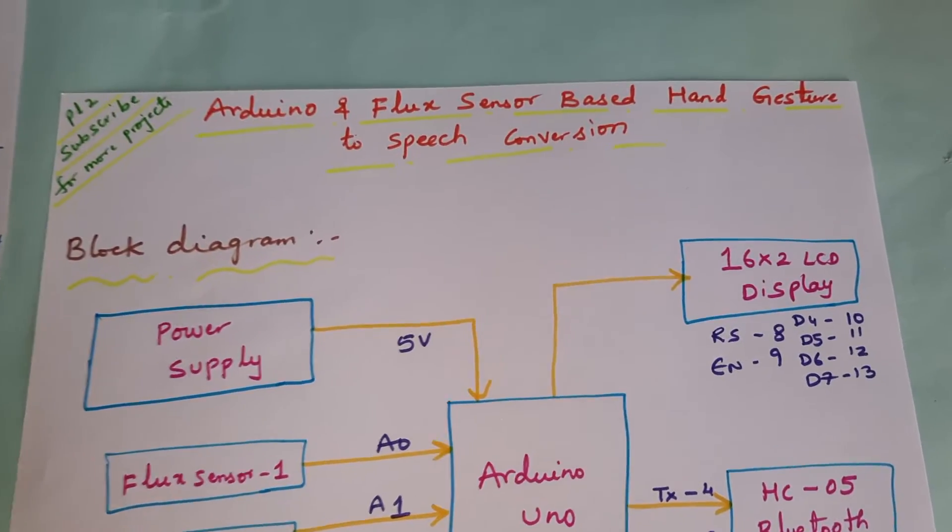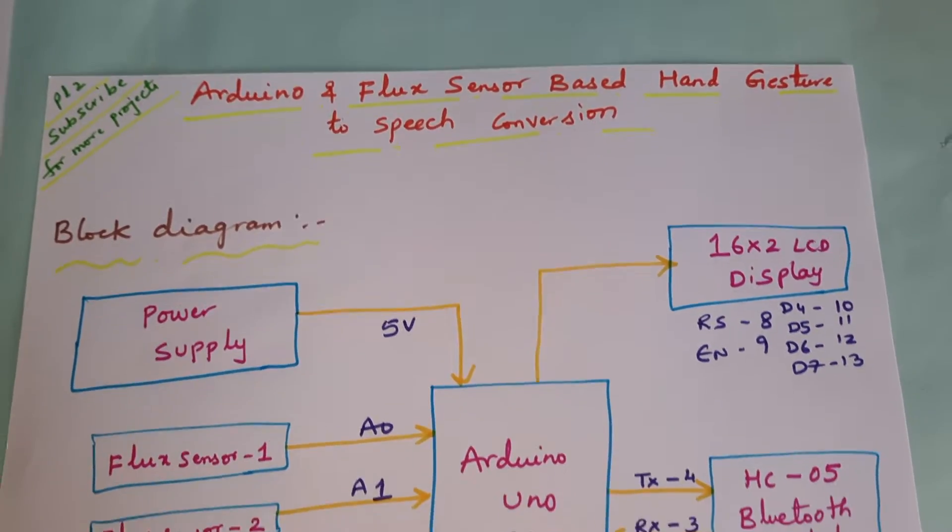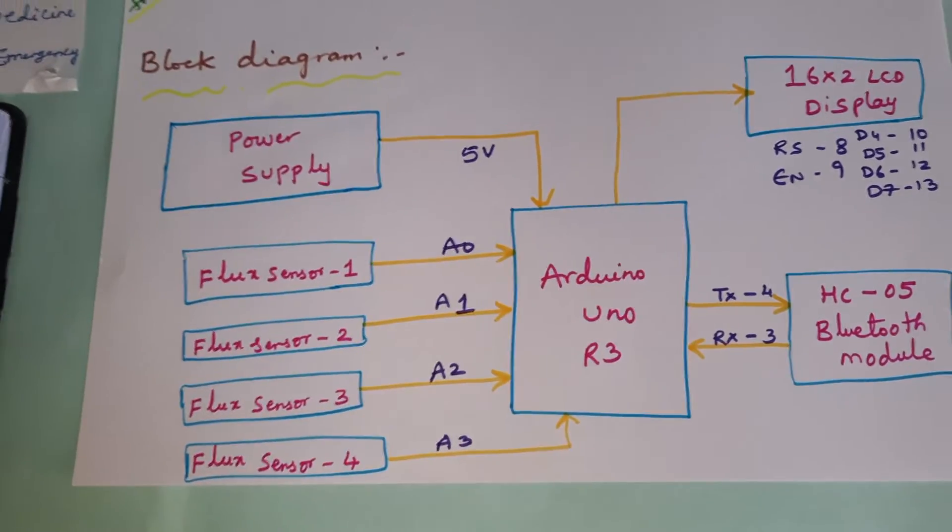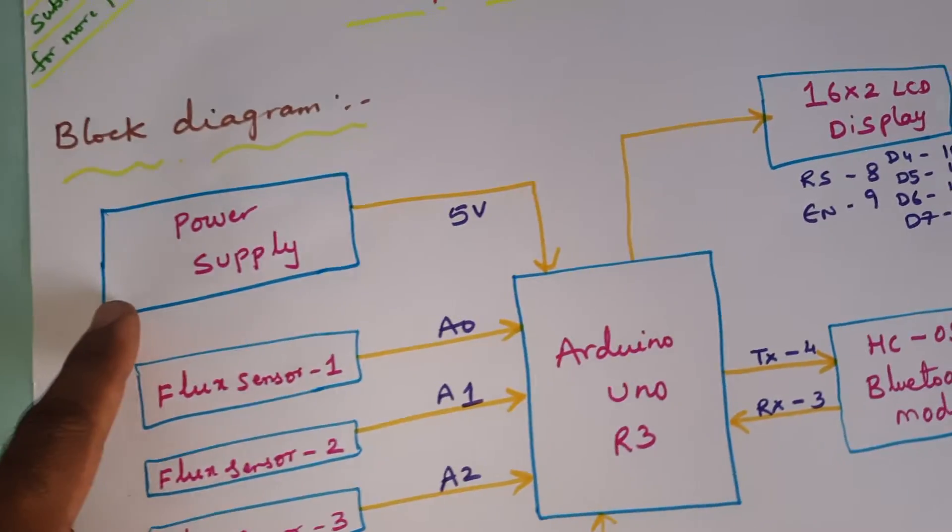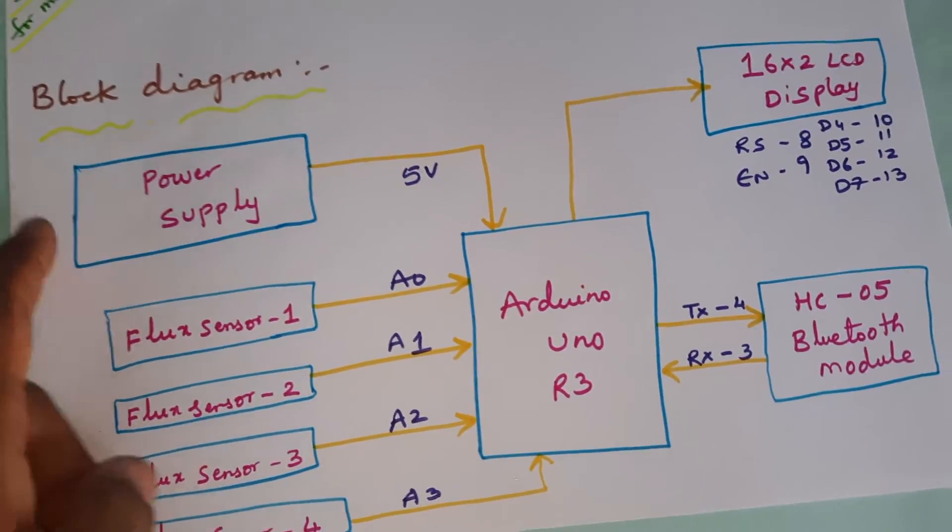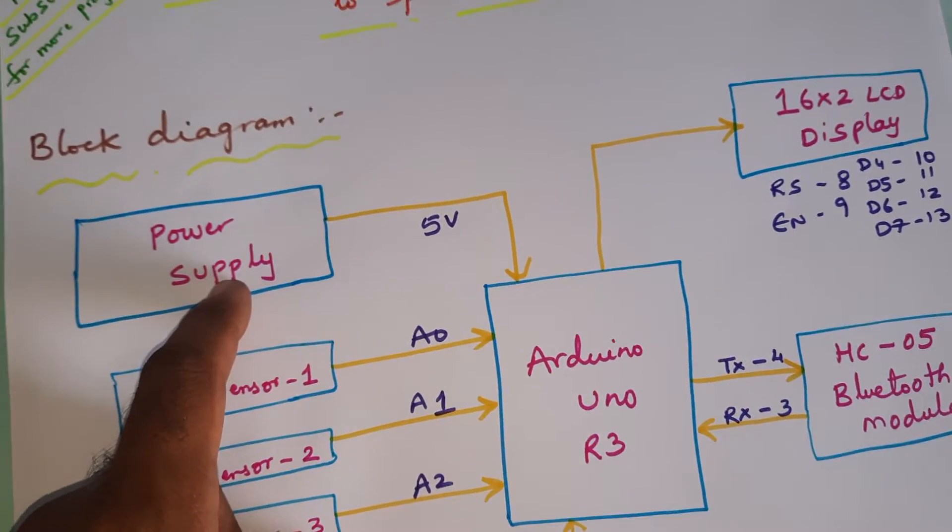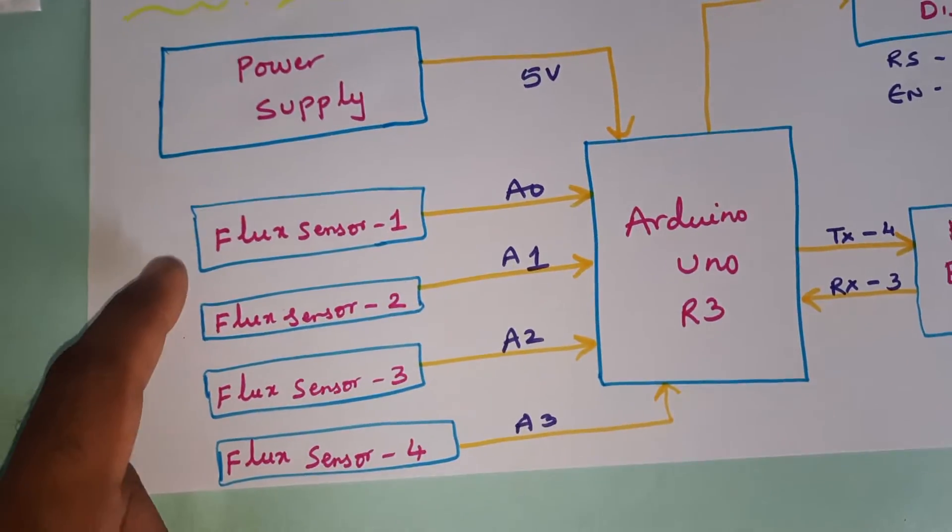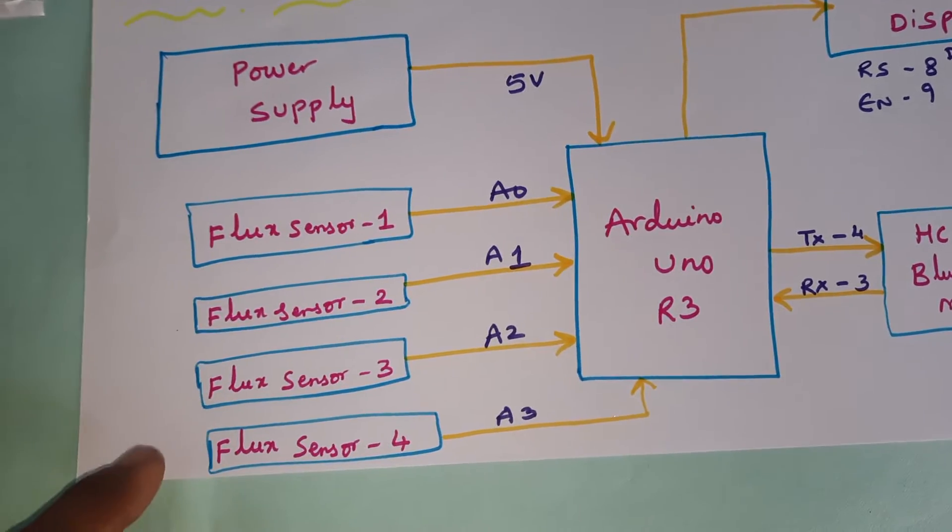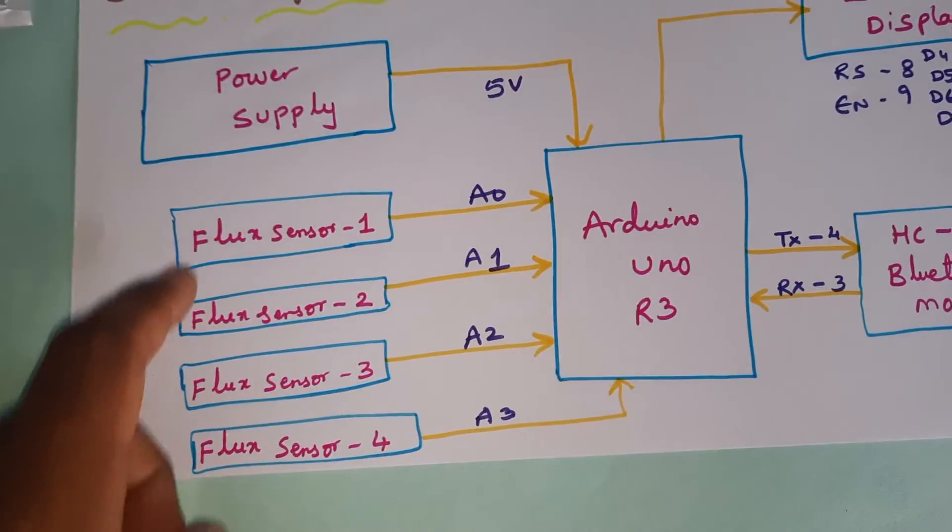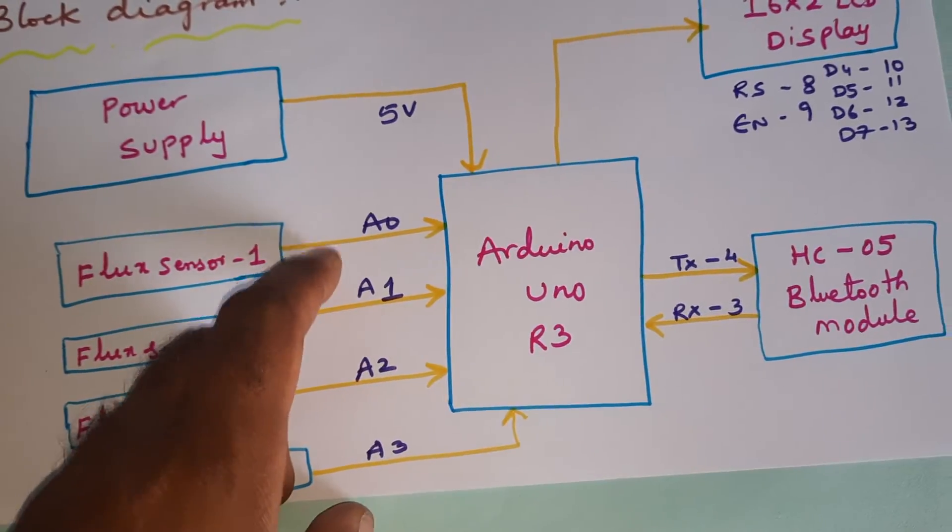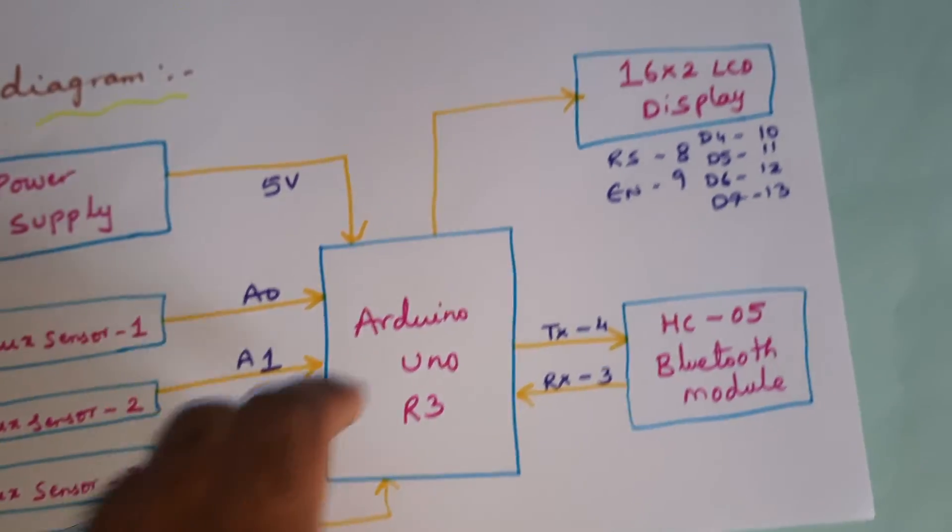Hi, Arduino and flex sensor based hand gesture to speech conversion. In this project we are using a 5 volt power supply module, 9 volt adapter into 5 volt pure DC output, Arduino Uno R3 board, and four flex sensors. Flex sensor 1, 2, 3, and 4 are connected with A0, A1, A2, A3.